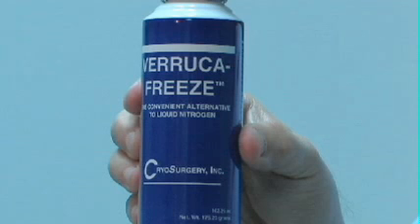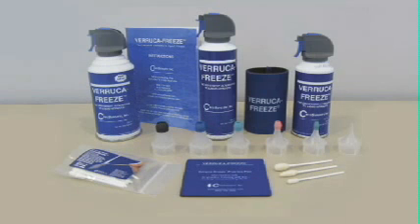Veruca Freeze is portable and can be easily carried throughout the office or taken to visit a large animal. The kit consists of a cryogen canister, an extender tube, instruction manual, set of reusable limiting cones, cryo buds, practice pad, and other accessories. Replacement canisters and additional accessories are also available.